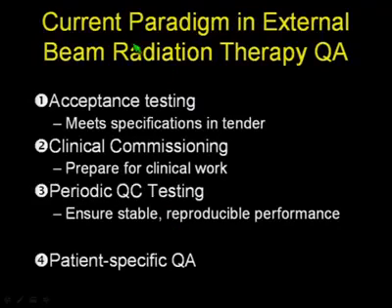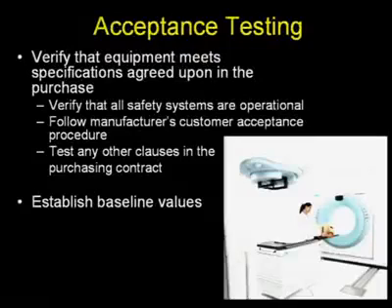And once all of these three items are dealt with, one can deal with the patient-specific QA that arises for this particular device according to the clinical use that you have back home. So I'll start with a few words on acceptance testing.